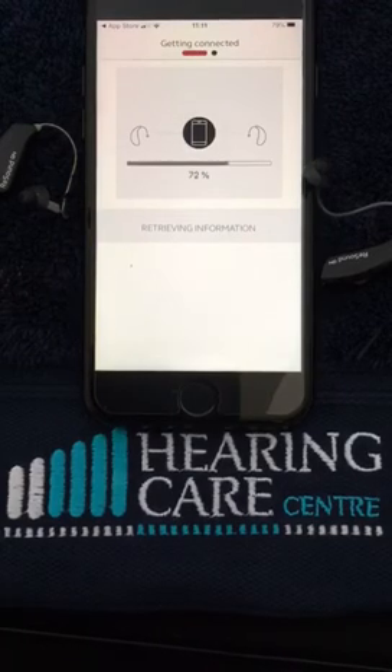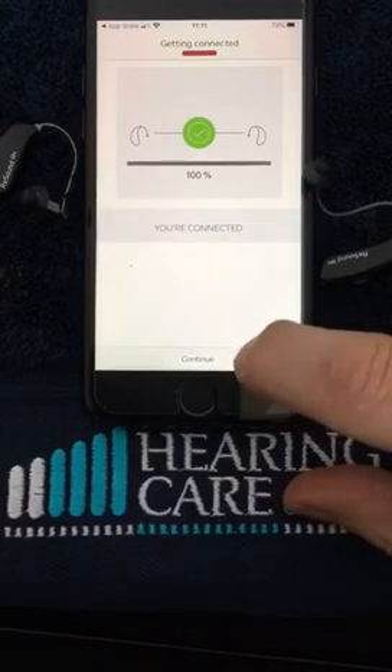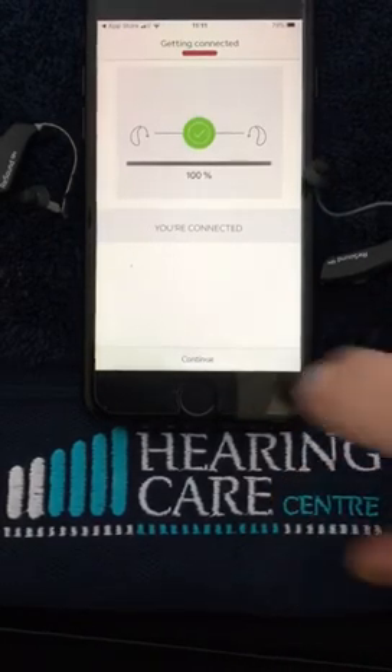As you can see it's now pairing them, and that's complete. So now we're connected — we click on the Continue button at the bottom.